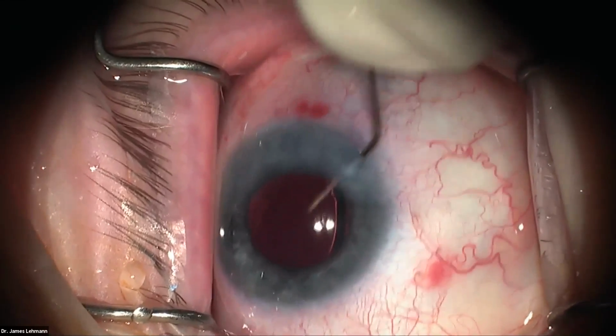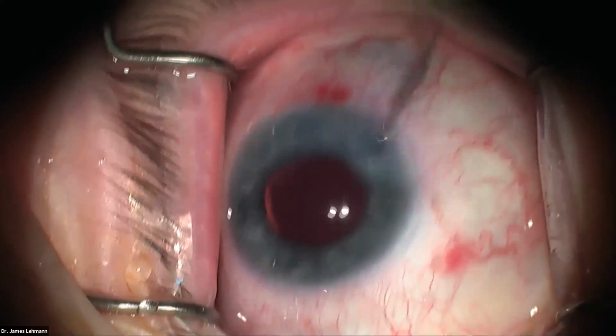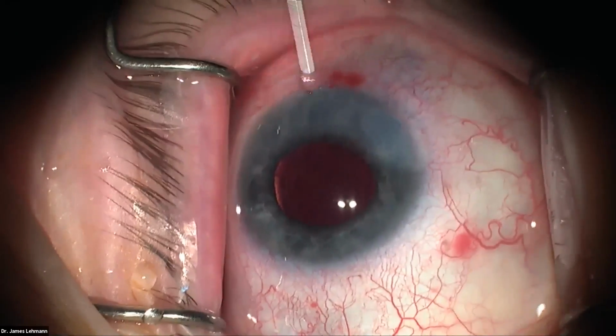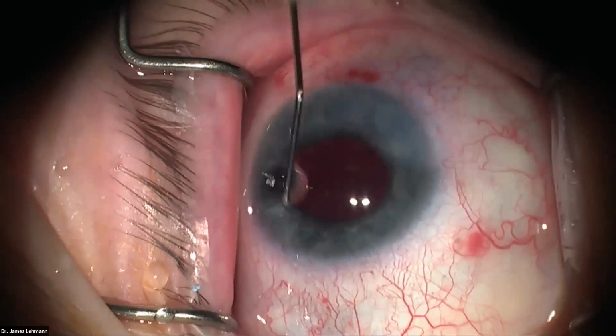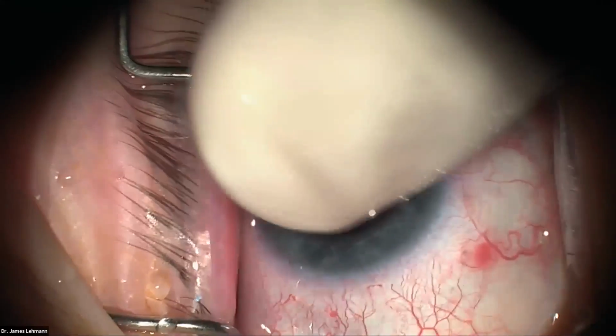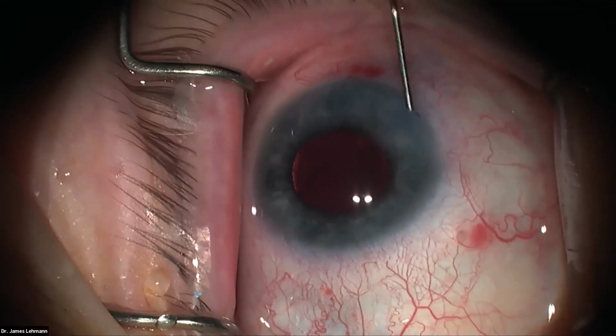And then I'm going to go in with my cannula and tap down on that lens and get it to center in the bag better. And then now I'm going to use a strong burst there. I'm looking to make sure there's no leakage here. And then I'm going to touch on the eye, still a little soft. And there we go. I touch now and it's pretty firm, and that's where we want to leave it.